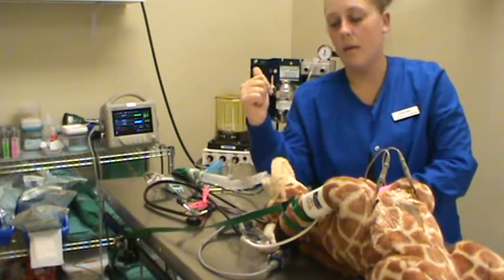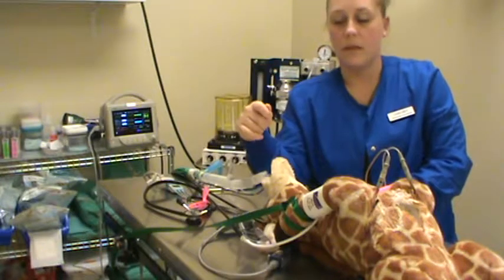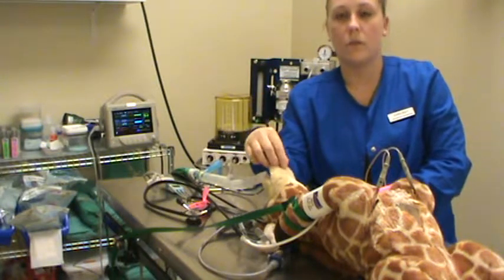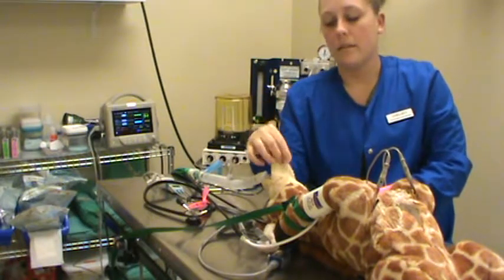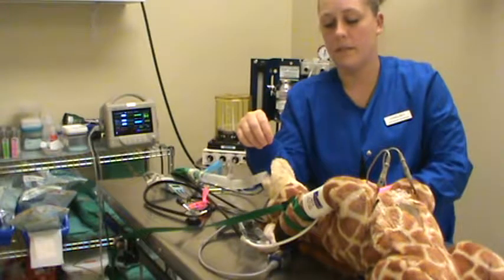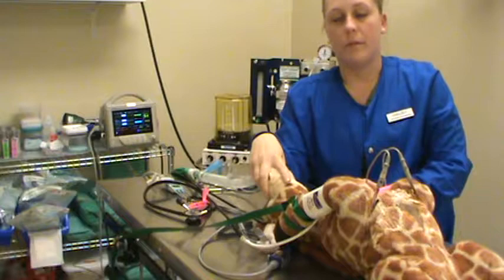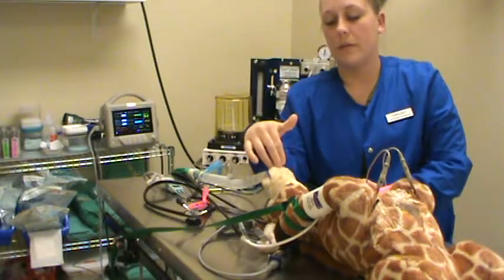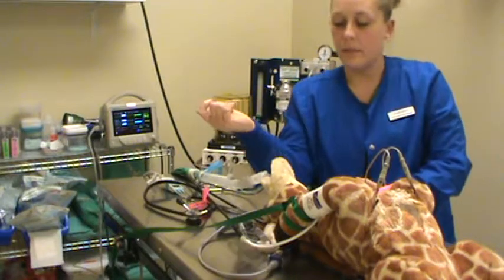So stage 2 towards the end, and stage 3, plane 1, is where we can intubate most patients. A lot of dogs will be intubatable in stage 2 towards the end. Cats sometimes need a little bit longer because they're a little more excited, I suppose. So they'll be more intubatable near stage 3, plane 1, where they're going to have a few reflexes present.